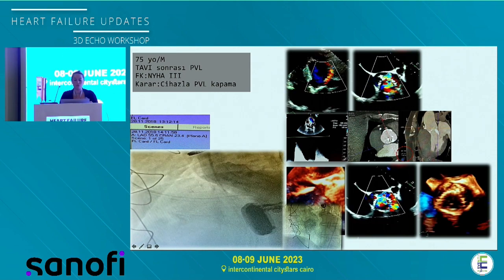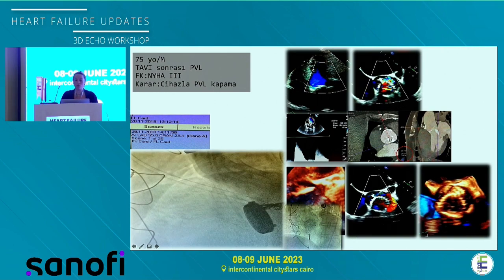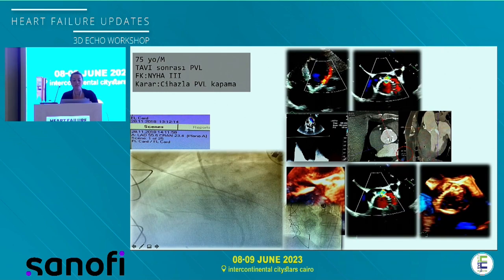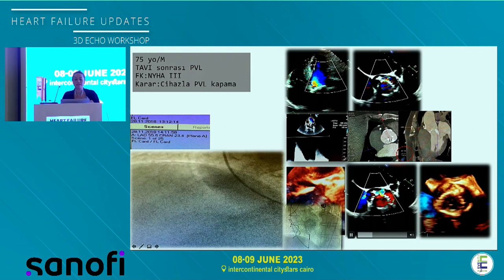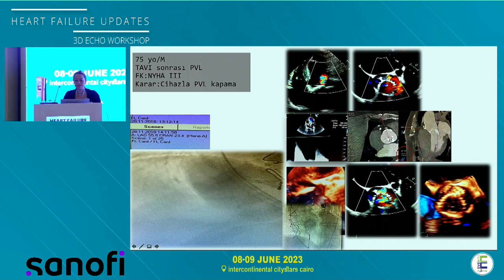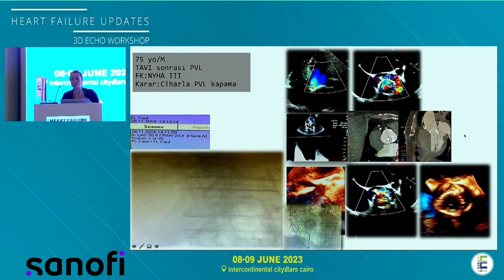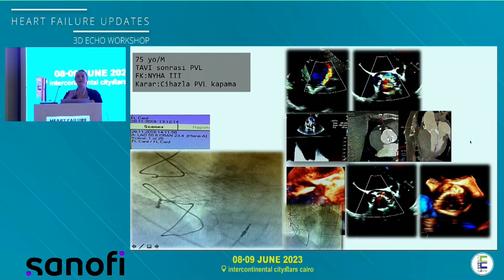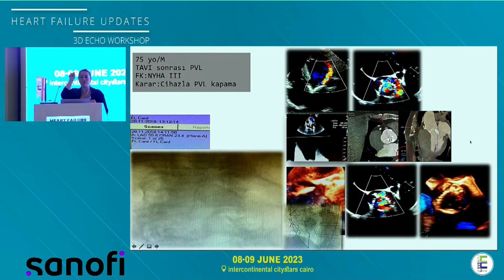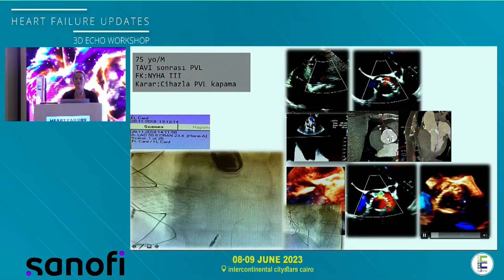We put the crosshair perpendicular to the expected defect, and we go to the 3-chamber view, we lateralize the defect, we find the angulation, and we find the same angulation on fluoro. In this case, we are going to the right wall of the ascending aorta, and again we crossed the defect with one shot, we put the device, and it was closed. It took again like 10 minutes.